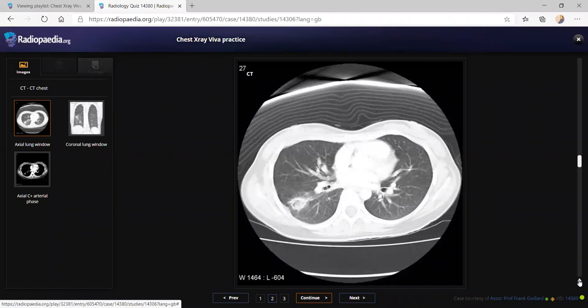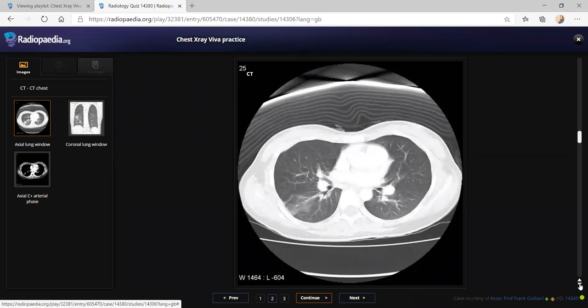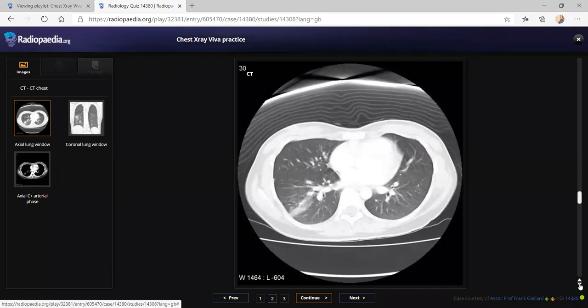What do you mean by aspergilloma? It's a fungal infection by Aspergillus fumigatus, and this causes a fungus ball within a pre-existing cavity. I would just retract this. I think this is a case of invasive aspergillosis where there is invasion of the surrounding lung parenchyma, which is seen through the surrounding halo sign. So this is an immunocompromised patient with an angioinvasive aspergillosis.